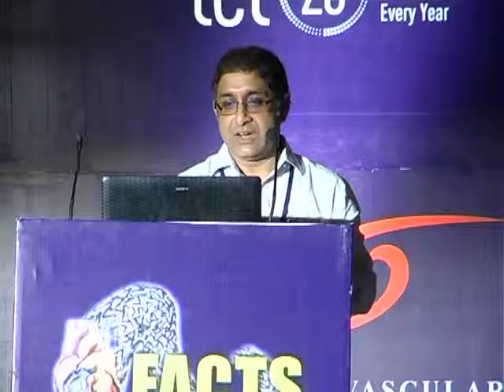So the point I want to make is that in some cases, aggressively changing the guide catheter to one which gives you more support can actually cause you more trouble. And you see that after you have done it, this artery looks much better. And this is actually a Taxus Liberty stent. You can see the 3x38 Taxus Liberty stent, implanting it is no problem at all.